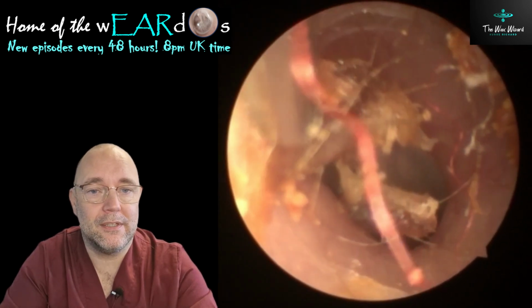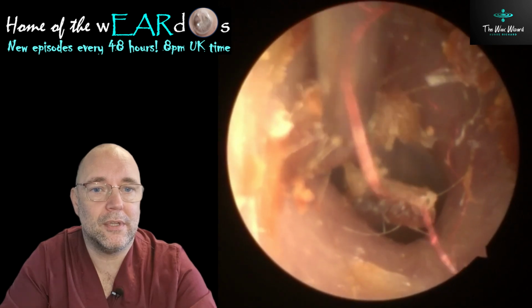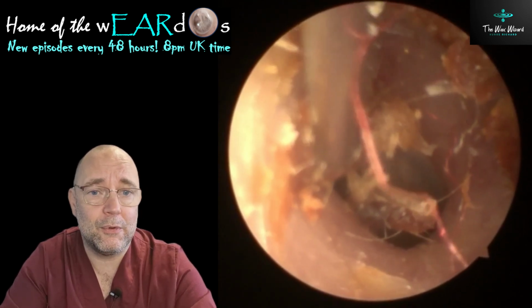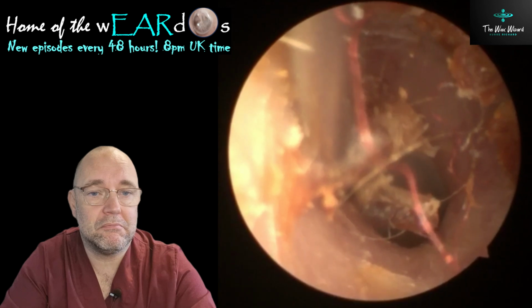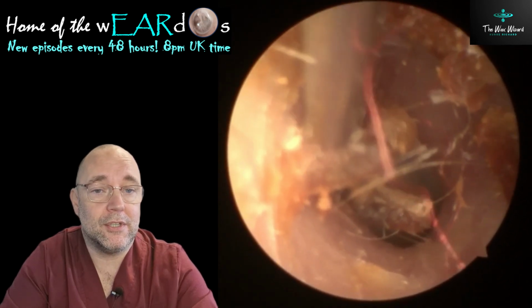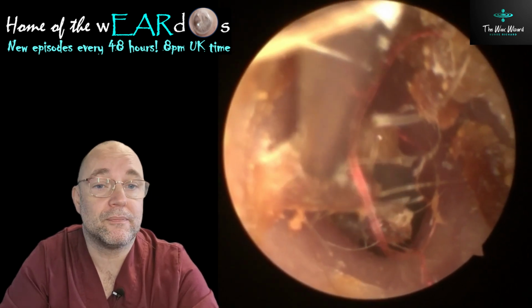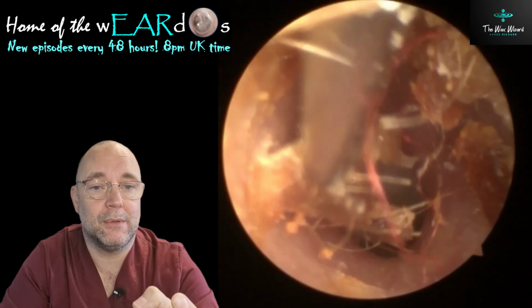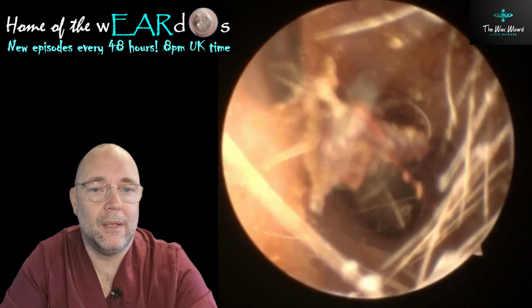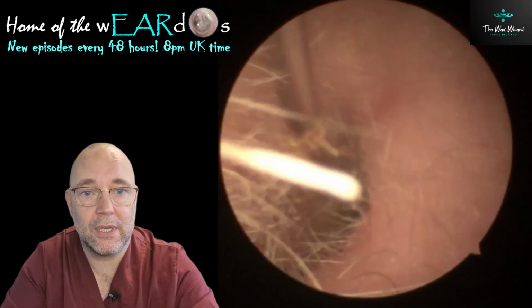Now this one here, you can see, can't you? There's like a red fibre right close to the camera, and I'm thinking, what on earth was that? Now I was baffled, as was the patient. He doesn't remember putting anything in there, and he said he doesn't even have any red clothes or red jumpers. He hasn't got the foggiest, but he came in because his ear was feeling a bit itchy and irritable. It was quite dry, but how they got in there, absolutely no idea.